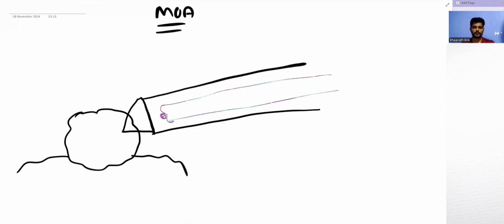Now, into this high pressure system, first you send the argon gas. The argon gas is under high pressure here. As soon as you open this valve, the argon gas will come here. As soon as it comes from the high pressure system, it is relieved from the pressure and rapidly expands. As it expands, it will cool down and freeze this probe. As the probe is directly in contact with the tissue, the tissue also freezes.